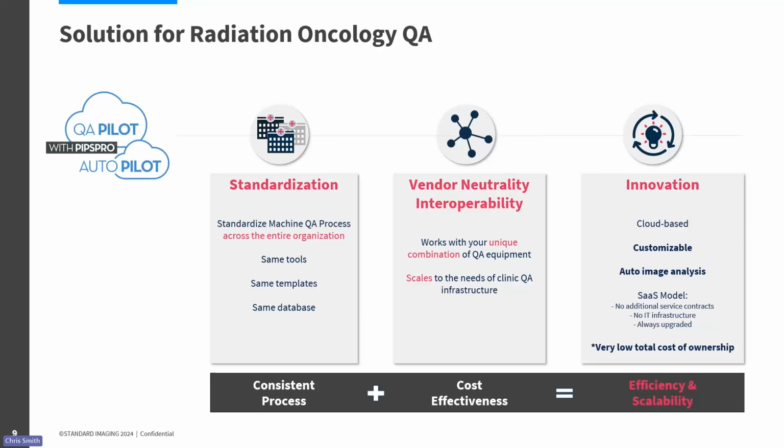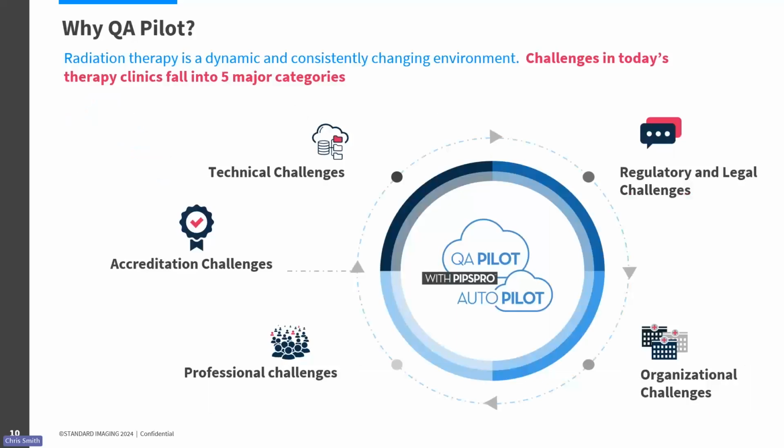And we recognize that being customizable really is the strength of the product that we'll talk about today. So a couple of things. So why QA Pilot? Well, QA Pilot really is a centralized data repository and key access points to your daily, monthly, and annual TG-based protocols, right? So it's completely trending analysis. It's completely customizable. It's a site-to-site workflow tool. It's a web-based product. It has integrated API capabilities.